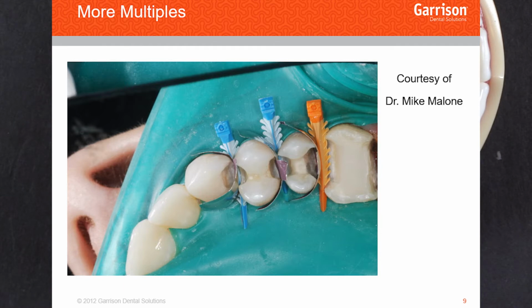But the purpose of doing just the one side at a time and not using the ring is, first of all, simply for the ease of placing all of the hardware. It's just so tough to get all that stuff in there. So by having it this way, it's a very easy way to get all those bands. You're doing 3 of the restorations at one time. Pretty efficient still.